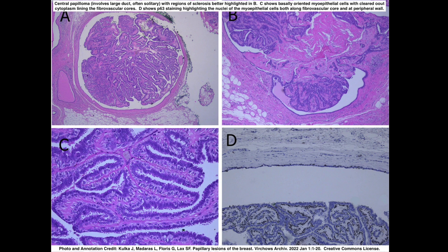Here is a histologic image of a central papilloma. It involves the large duct and has regions of sclerosis, better highlighted in panel B. Panel C, looking closer, shows basally-oriented myoepithelial cells — cells with clearer cytoplasm — lining the fibrovascular cores. Panel D shows P63 highlighting the nuclei of the myoepithelial cells. As you can see, it's intact, as well as the peripheral wall where the myoepithelial cells are highlighted.